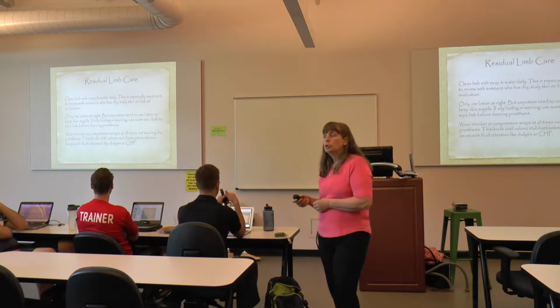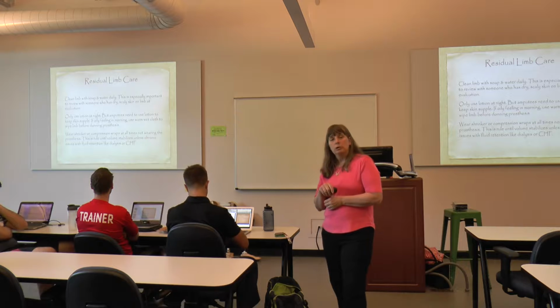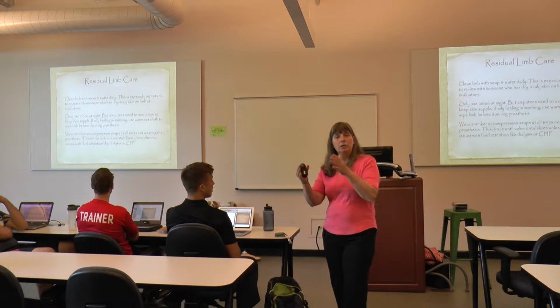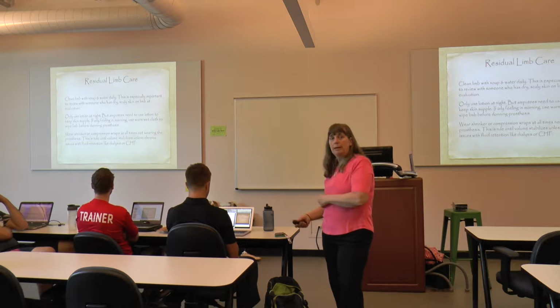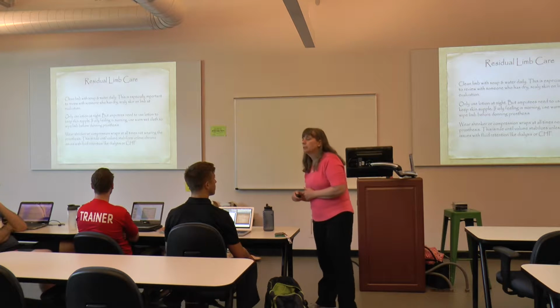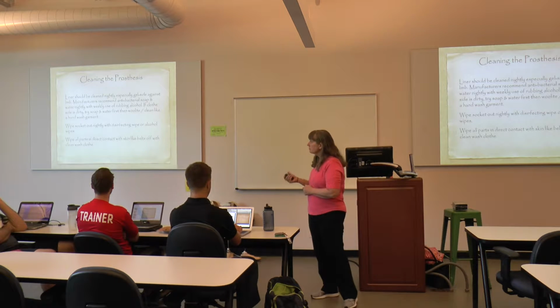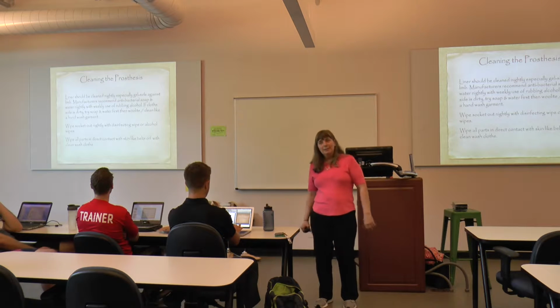So if we talk about twice a day wear, which we are going to talk about, that means to put the shrinker sock on between it. I wear the prosthesis whatever time I say, shrinker sock, wear the prosthesis again, and then put the shrinker sock back on. They should have at least, if they're wearing shrinkers, 2 shrinker socks to be rotating between them at least every 2 days. Okay, cleaning the prosthesis. Yes, it doesn't clean itself, guys.